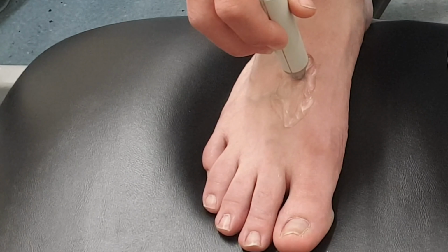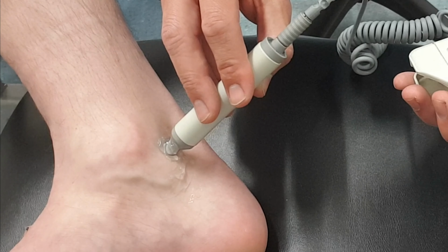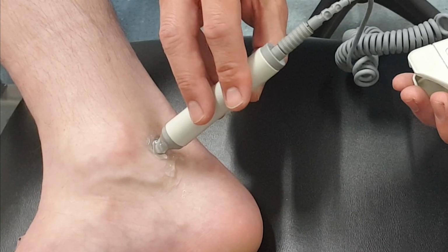Next one we're going to go for is the posterior tibial, and the posterior tibial artery runs between the medial malleolus and the Achilles tendon, and you'll find it usually slightly further up here, so it's not quite in that little cleft. So similar sort of thing, but you start this way and work across. So again, plenty of lubricant. And there we go. Slightly different sound because it's a different type of vessel, but a decent signal.